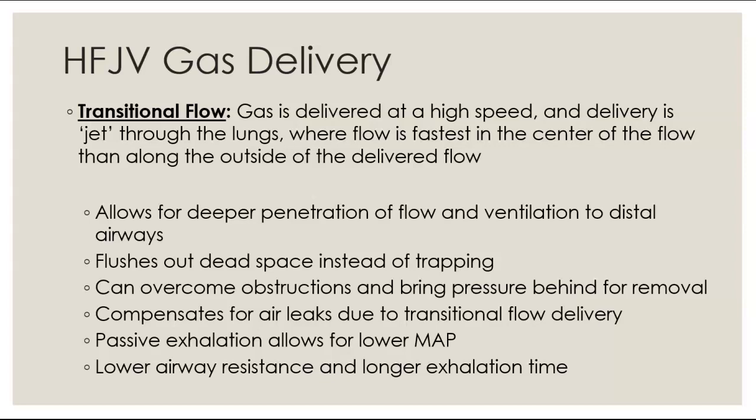And then the passive exhalation is what helps move secretions up and out, and is what allows for that protection and prevention of air trapping to occur. So this allows for deep penetration of flow ventilation to distal airways. So again, we use it to jet, because it's the jet ventilator, to those distal airways that we need. We flush out dead space instead of trapping. That is part of that passive exhalation. So instead of having air trapping occur where we don't fully exhale, this passive exhalation is able to move out in order to allow for air trapping to decrease and that dead space ventilation.